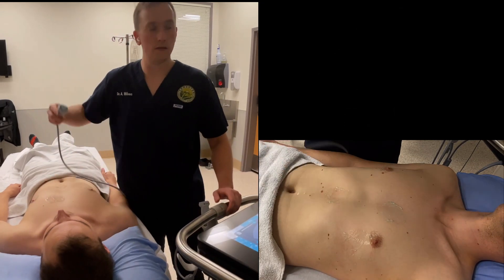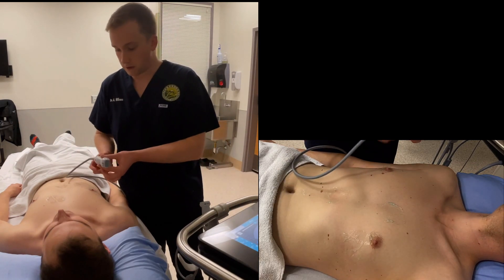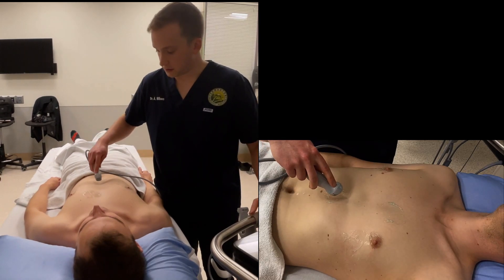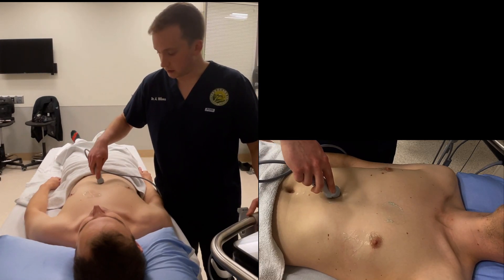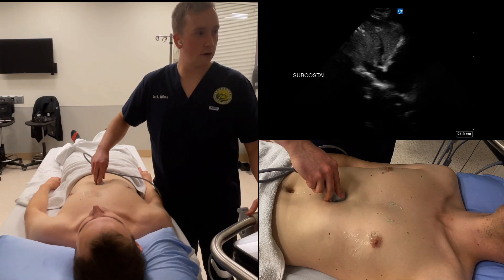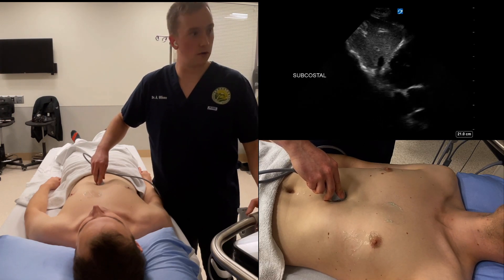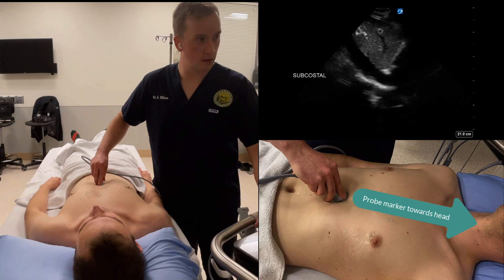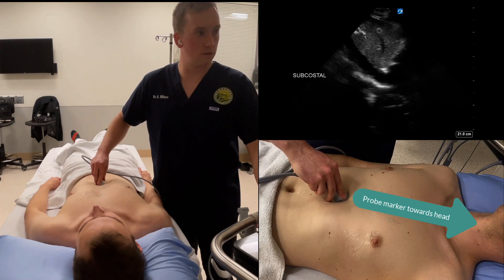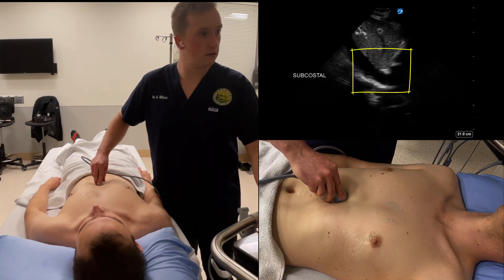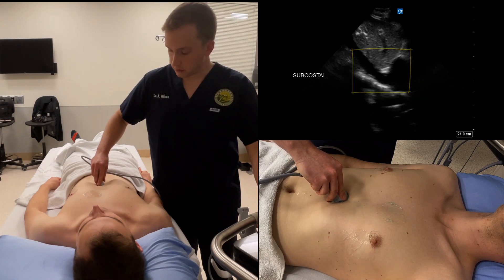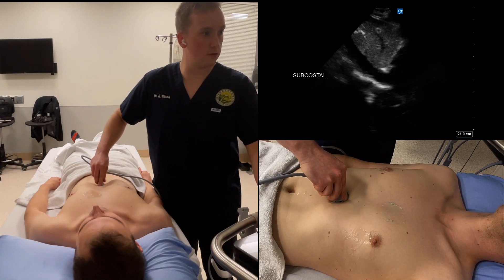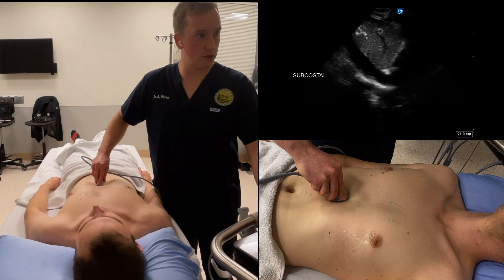The next view is the subcostal IVC view. To obtain this view, place the probe immediately below the xiphoid process with the probe marker facing the patient's head, and slightly right of midline. Practically, this can be found by first finding the subcostal four-chamber and then rotating the probe so the marker is facing the patient's head. Our area of interest is generally the junction of the right atrium and the IVC. You may need to angle the probe with the handle pointing upwards and the tail slightly caudad to find this junction.